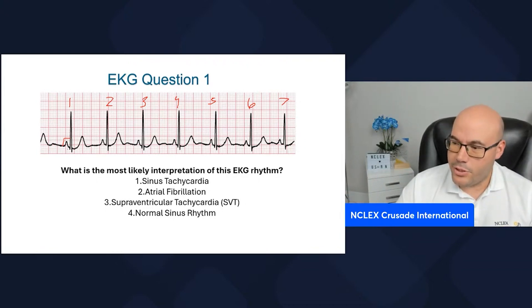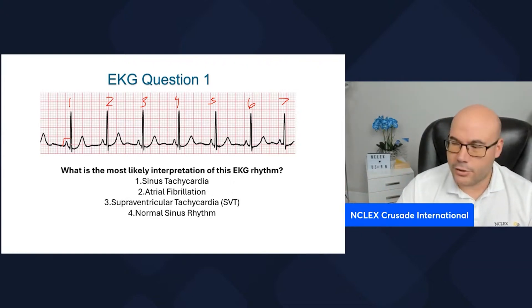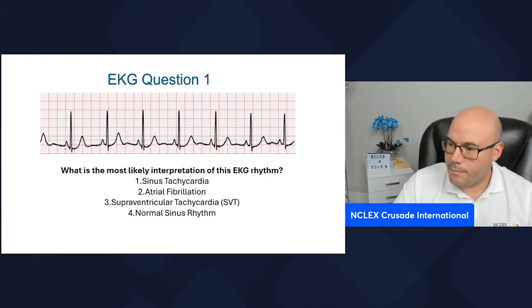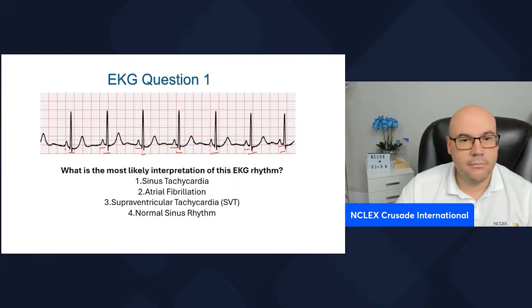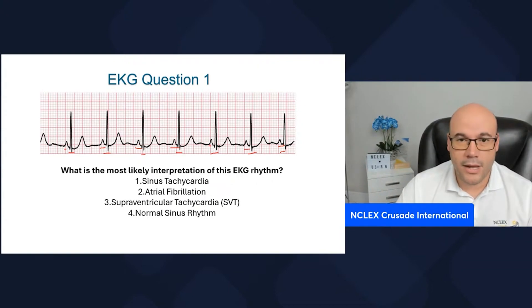The QRS interval — the space between the Q and the S — needs to be approximately less than 0.10 seconds, which it is, so we have a normal QRS interval. And we have a P wave for every QRS complex — P-QRS, P-QRS, throughout the strip. So if the rhythm is regular, the heart rate is normal, the PR interval is normal, the QRS interval is normal, and there's a P for every QRS and it's constant — we are in the presence of normal sinus rhythm.